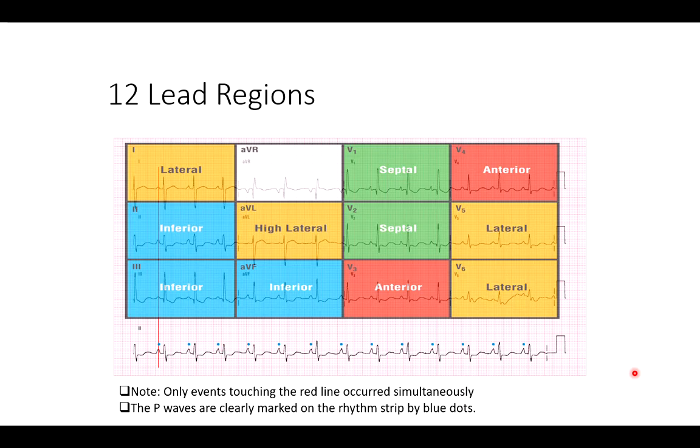And that dysfunction may be looking simply at the PQRST to indicate what part of the electrical rhythm strip is impacted, but it also may look at what part of the EKG leads 2, 3, AVF, for instance, because that gives us an indication of what part of the heart, myocardium, may be impacted. And if we know our anatomy of the heart and the myocardium, we might be better able to understand what coronary vessels may be involved.